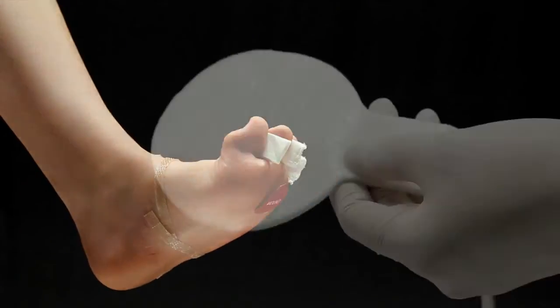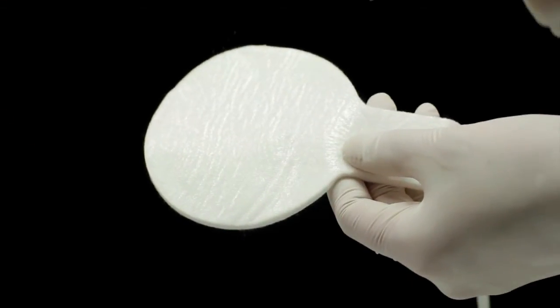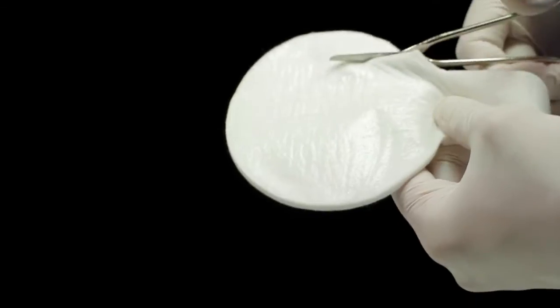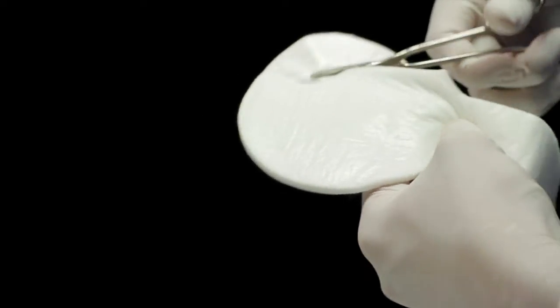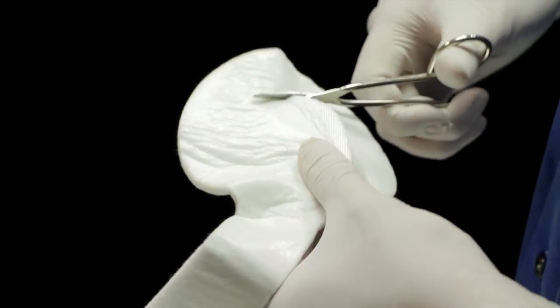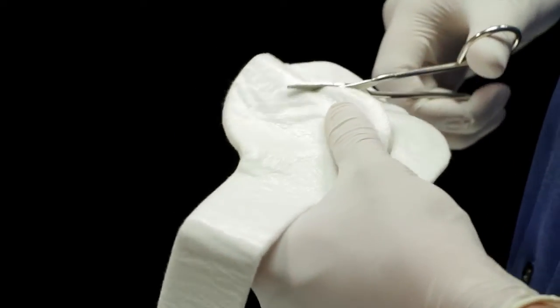Remove the large spoon-shaped pad from the packaging. Trim the circular portion of the dressing to cover and extend to the edges of the wound. Note that if the wound is on top of the foot, a piece of the dressing should be placed under the foot to prevent maceration.